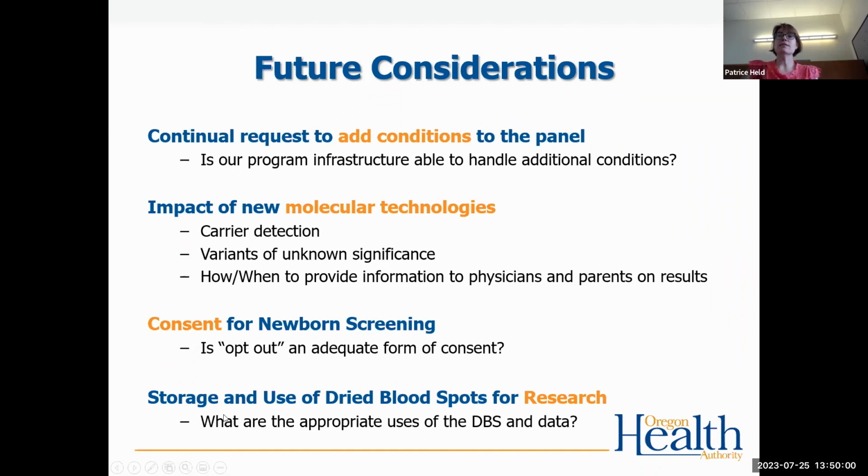And lastly, there are considerations around the storage and the use of the dried blood spot specimens for research. What should we be using the blood spots for and the data for? And what types of research are appropriate or not appropriate?